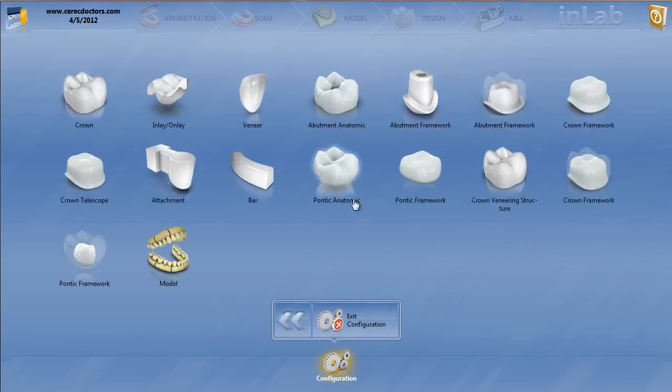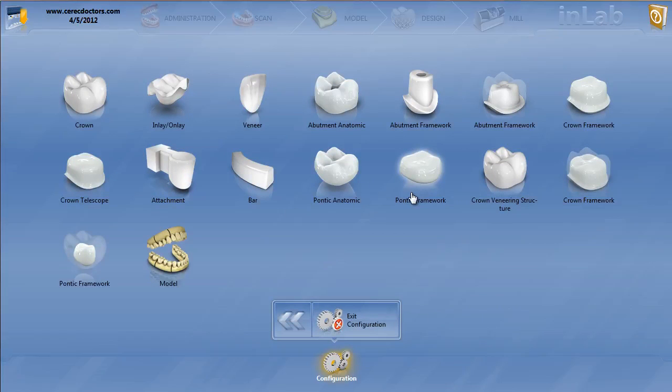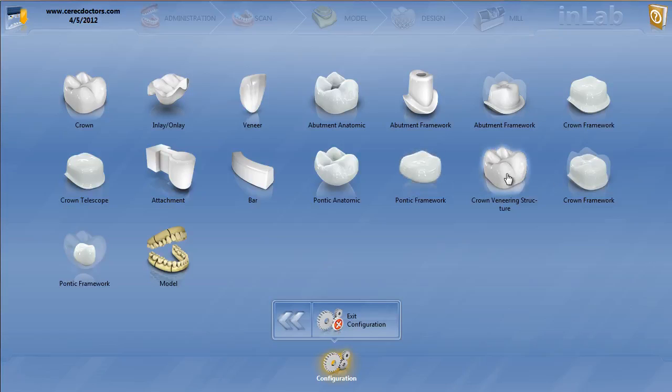So that takes care of the veneering structure and the crown and pontic framework parameters for multi-layer. I will definitely get into many videos on how those designs actually work. The main thing to remember is always make sure you have the minimal thicknesses set real low for both. And also you have the telescope angle up a little bit high and have the spacer a little bit higher for the veneering structure. And then you should be okay.